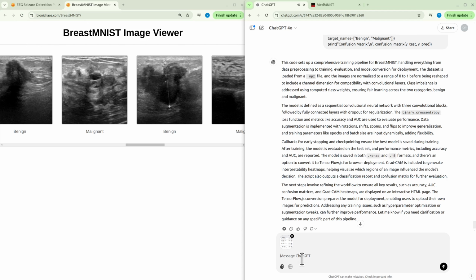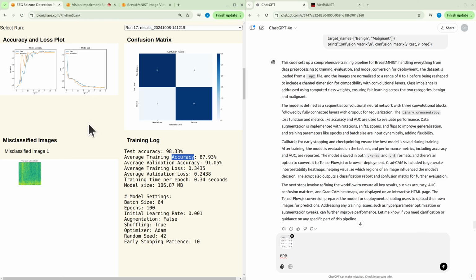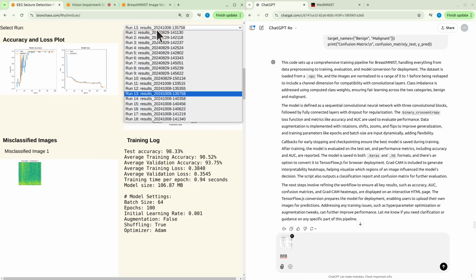Yeah, we're really going into the woods on this dataset. Before, we had the Python thing, Flask. So this thing has a Flask backend, so all the data is stored on my server, and I'm serving it that way. That's with Rhythm Scan.